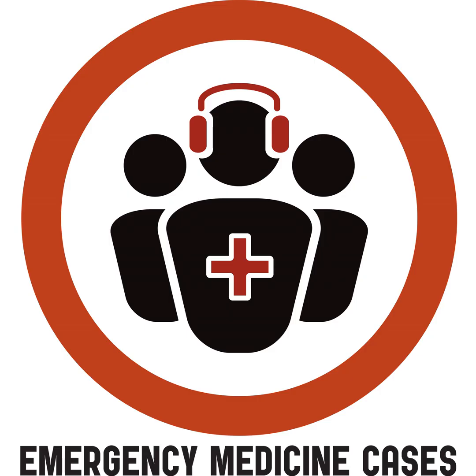So practicing video laryngoscopy, optimizing video laryngoscopy. And that's a whole other podcast, perhaps at one point. Using PPE, you have to be able to progress through that algorithm with that equipment on, and you need to train yourself to do that. And then you need to train as a team. And that team detail in terms of the sequencing, when you disconnect, when you change your flows, all of those little things have to be perfectly, or as close as you can to perfectly, orchestrated. And so we need to spend time on that. We need to use checklists. We talk about that a lot, but we haven't been doing it. And this is the time to do it.